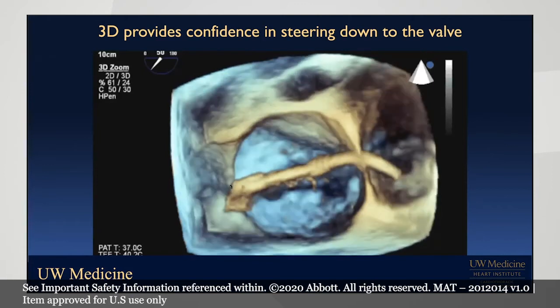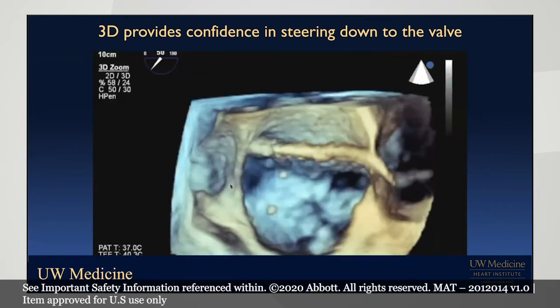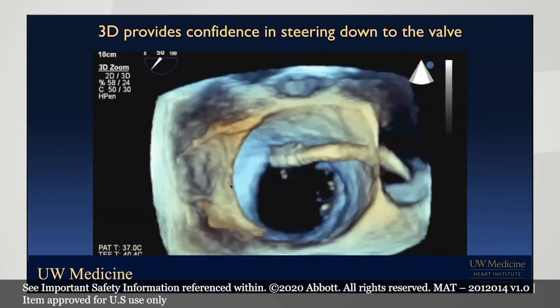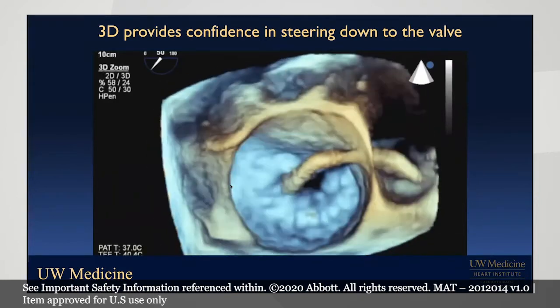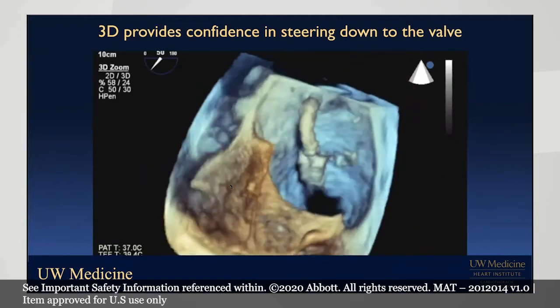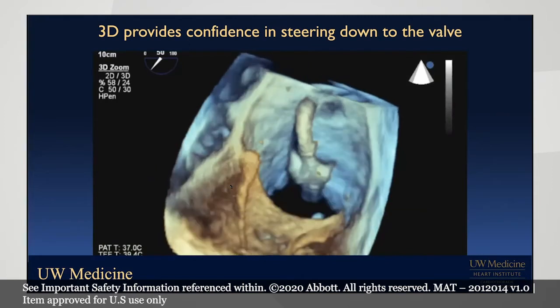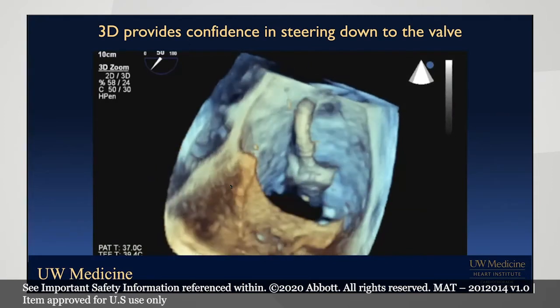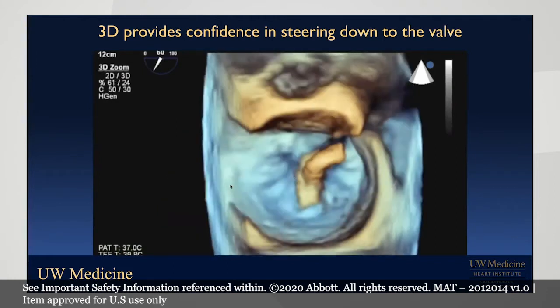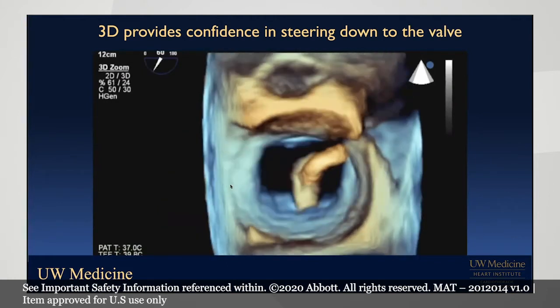As I'm playing this, you see how in a stepwise fashion we're navigating the Coumadin ridge and then coming from anterior lateral towards the center of the valve, still being above the valve, as I show now from a side view. Then we can open the clip in order to look at initial perpendicularity or other items that are important to consider.